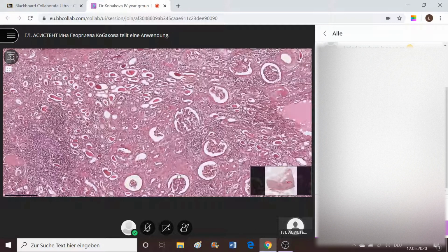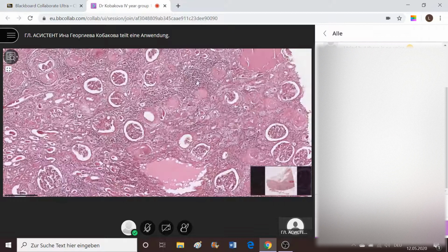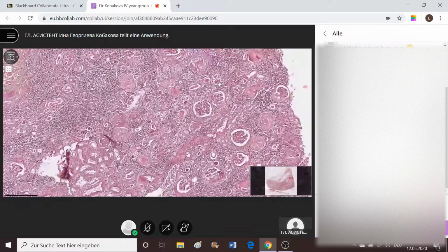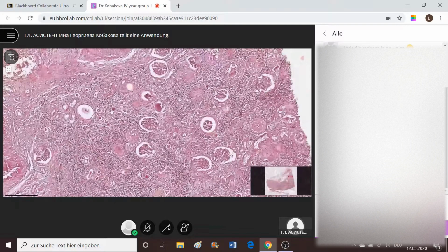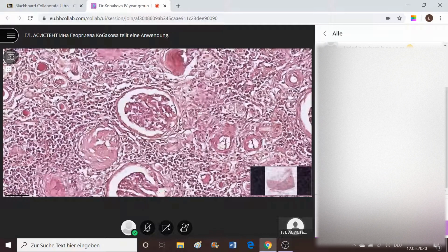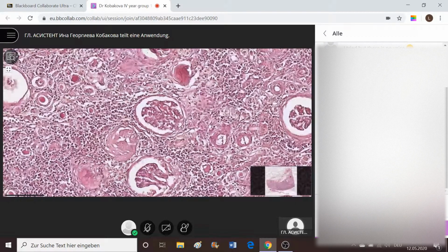What we observe here are glomerular structures which are very evident for normal. What we observe here is a particularly well-kept healthy glomerulus with just a thicker Bowman capsule and a little bit enlarged Bowman space. But it's not everywhere like this.